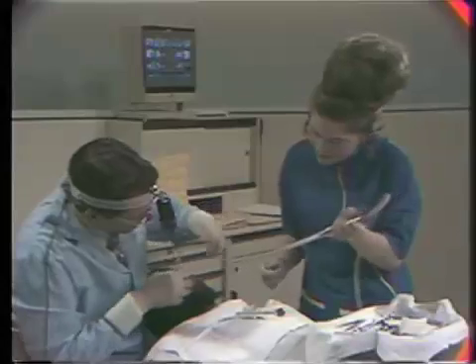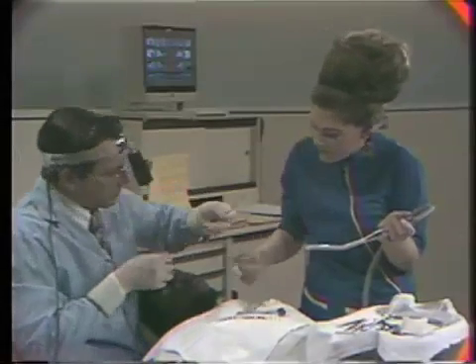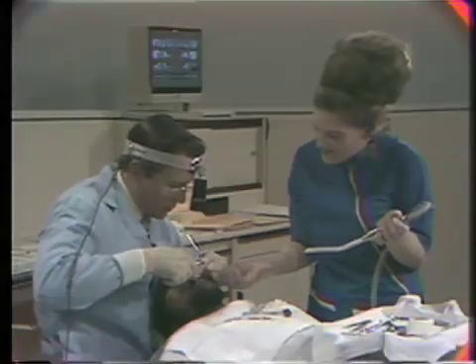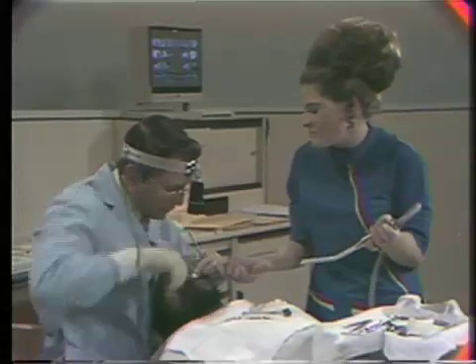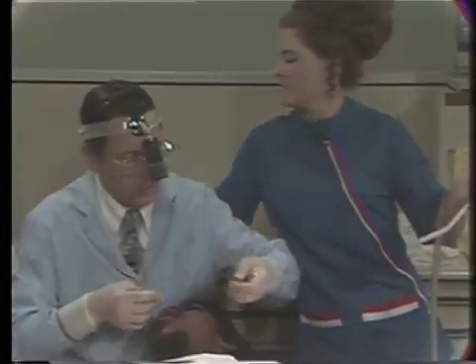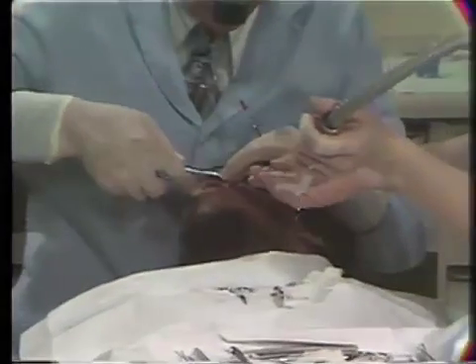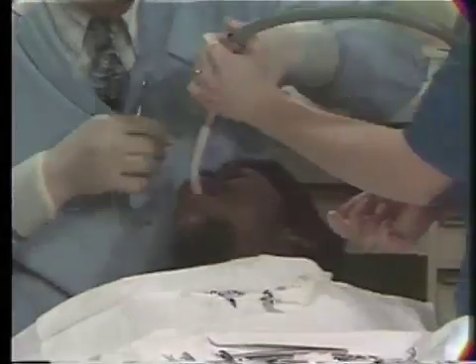But I've often said that if I ever had to go back to doing all the things that these gals do for us, I'd just absolutely quit the practice of dentistry. They not only increase our efficiency, they increase our quality of operation, and they decrease the potential we have of having ulcers. Now see how well she watches me and even gets the cord around behind my back? If my collar gets out of line, she even puts that back in position once in a while.